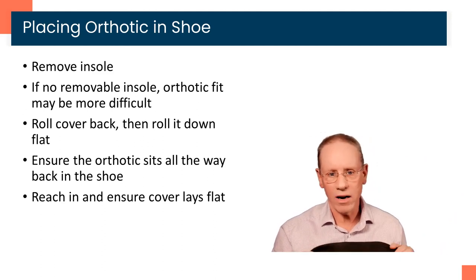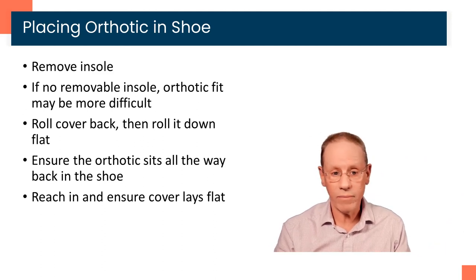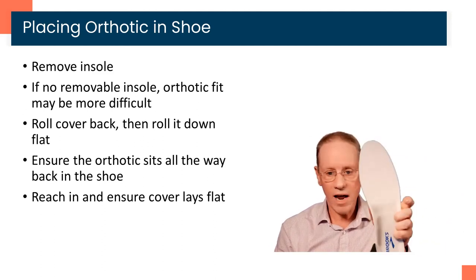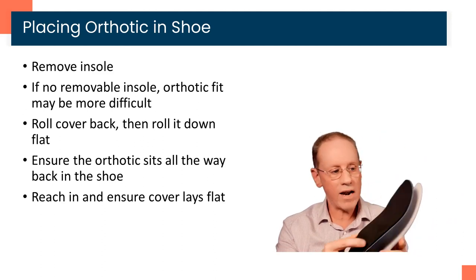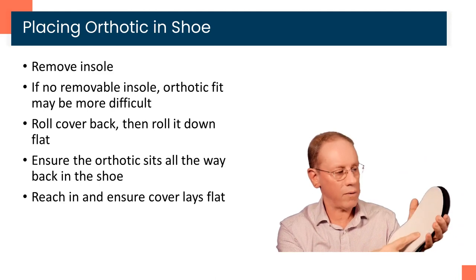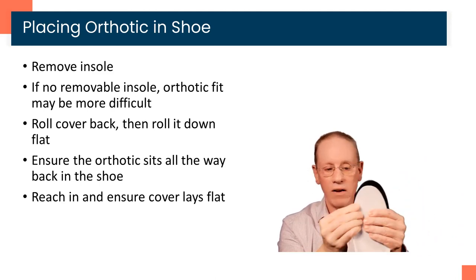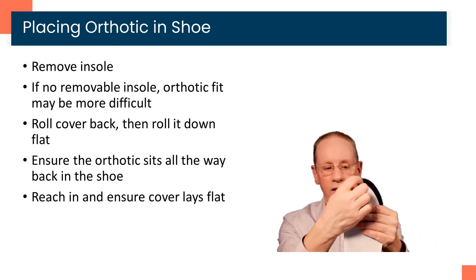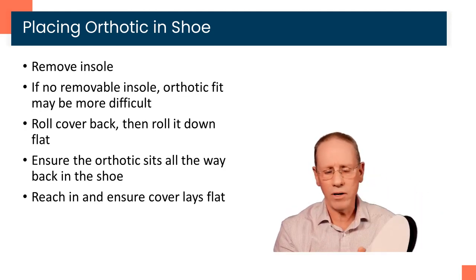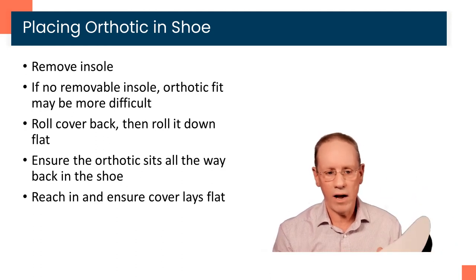If the cover feels like it's curled up at the end, that's a sign it may need to be trimmed. In general, we're going to leave the orthotic cover a little too long rather than too short, with the idea to trim it. An easy way to trim it is to simply take the insole and use that as a template. You always leave it lined up on the big toe side, then trace it and trim it. We're happy to do that for you if you're in the office, but if not, you can do that yourself.